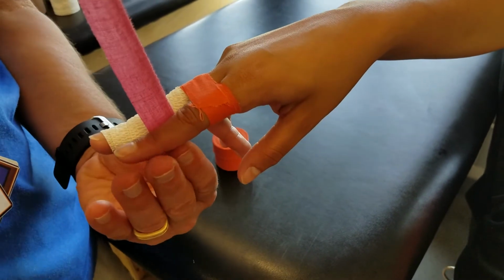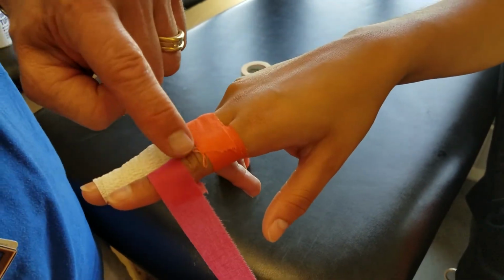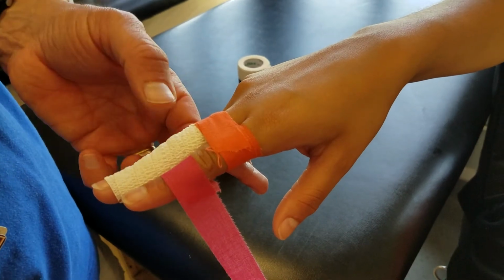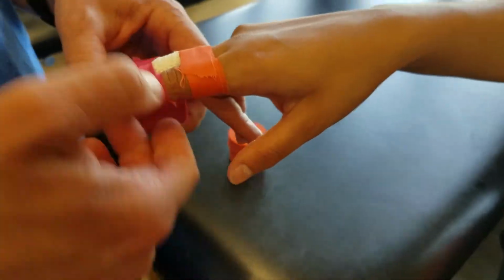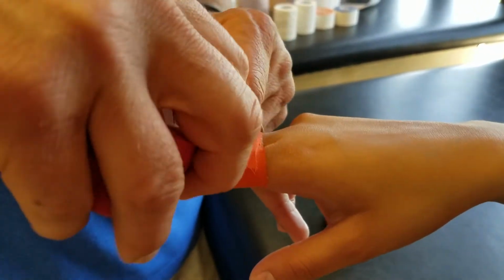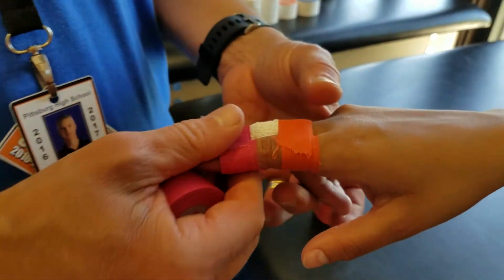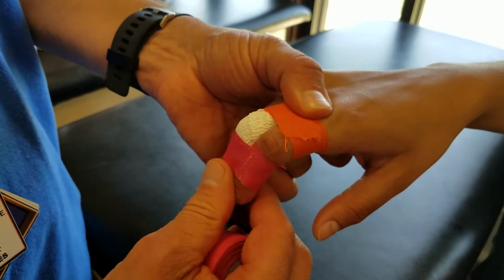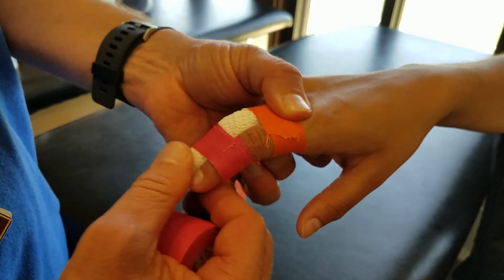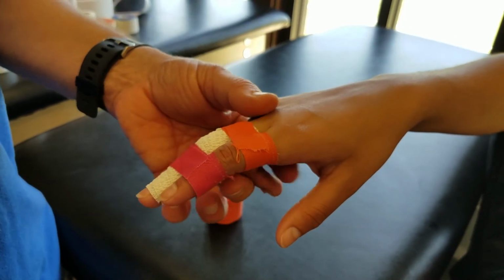Have them open up a little bit, and I'm again between the joints, so between the PIP and the DIP. Same thing, we come around here between the PIP and the DIP. Once around, bring it back up, and then twice, and tear that off. So then it also becomes a functional, moving finger too, with support of the other non-injured finger.